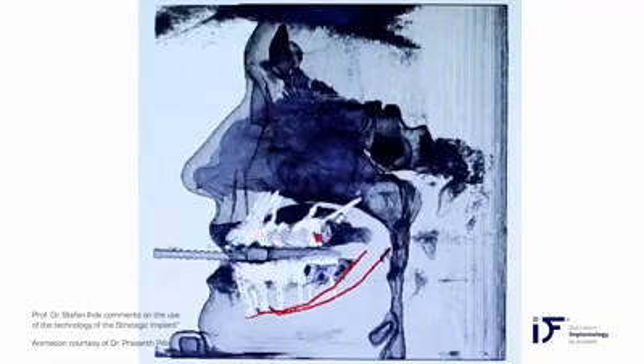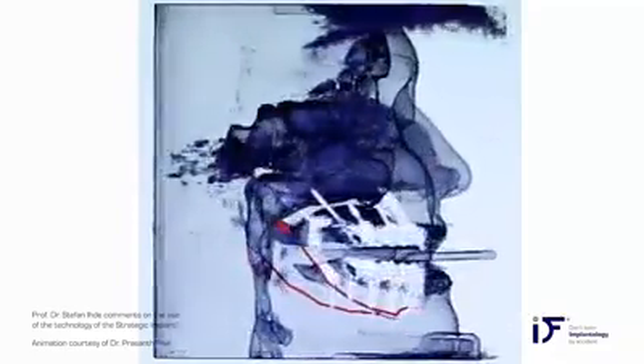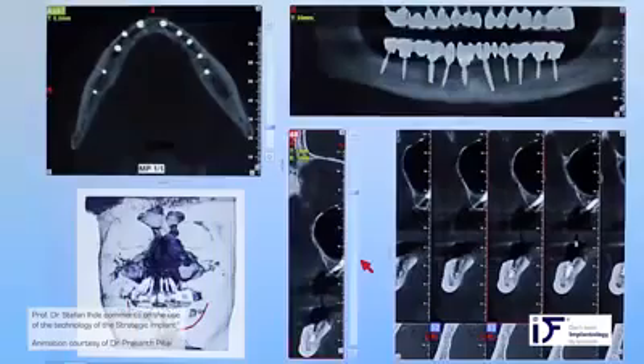Here you see different visualizations — the soft tissues of the patient, the sinuses, and the approximate relationship between the soft tissue and the implants. Later in this film we will also see sagittal panoramic cuts, and I will explain more on this. There is probably no anterior contact — we don't do any anterior contact. These are the overview pictures, a panoramic-type view showing the combination of compression screws and strategic implants placed in this case.